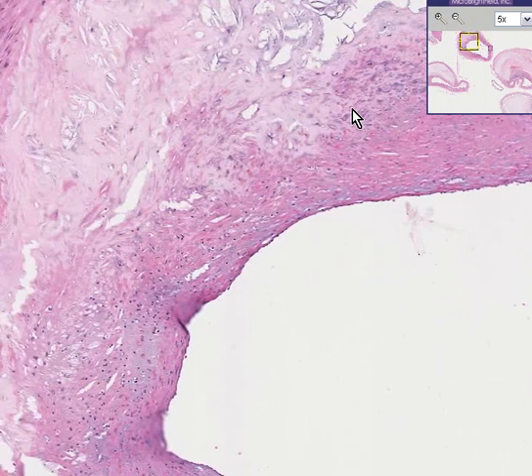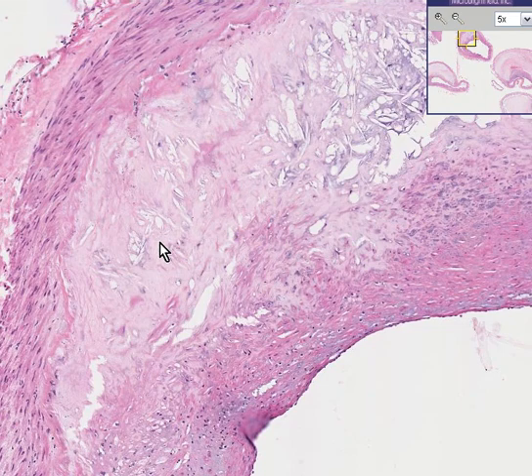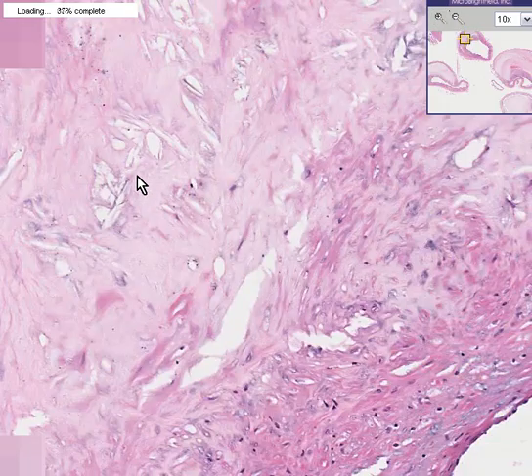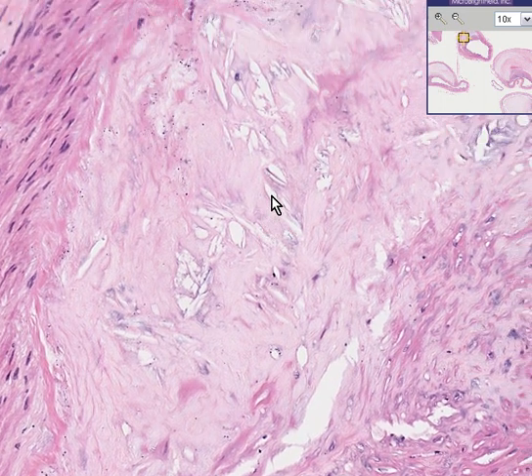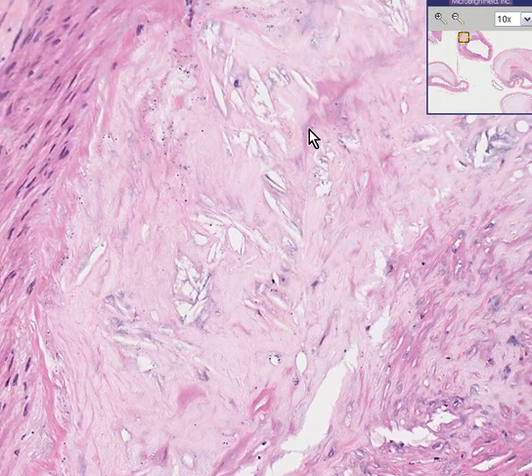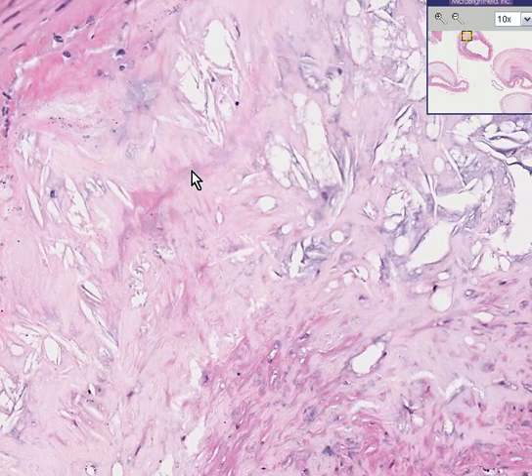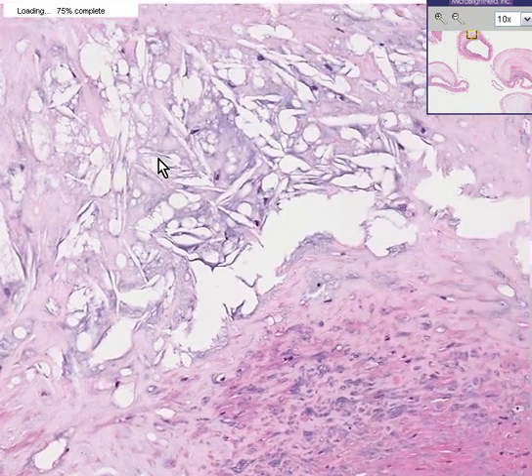Now in this part, sub-endothelially, we have tremendous amounts of fatty material deposited, which is chiefly cholesterol and cholesterol esters. Notice how cholesterol frequently deposits as needle-shaped slits called cholesterol clefts. Please note that most of this material is within macrophages, or originally was in macrophages — now it's just one fatty glob. Look at all these cholesterol clefts.